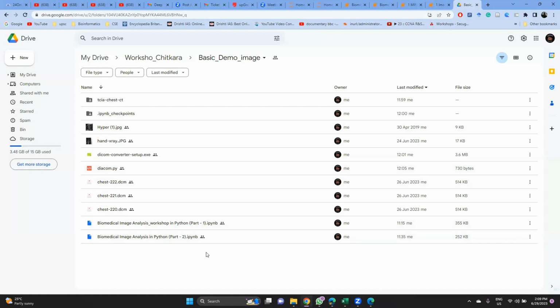So we can build a tool if we use Python based GUI programming, and then we will integrate that code in the backend, and this will do all the things for you. In this way we can make a particular tool out of these cheat sheets that are available over here. You can download them on your systems, and later, when we are doing this live demo over here, you can perform it at that particular time also.